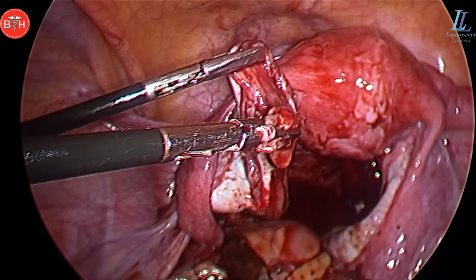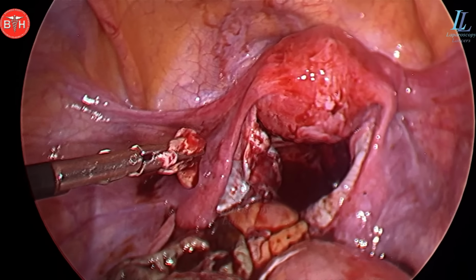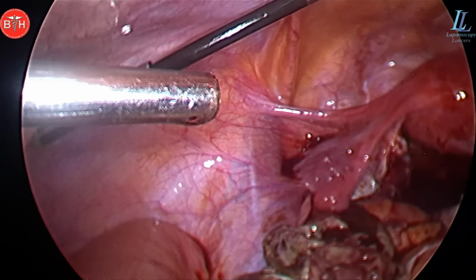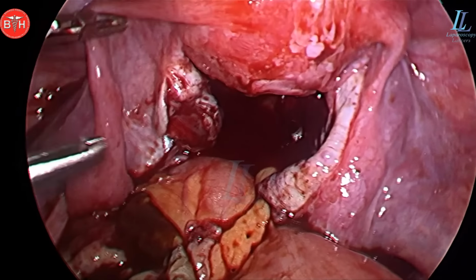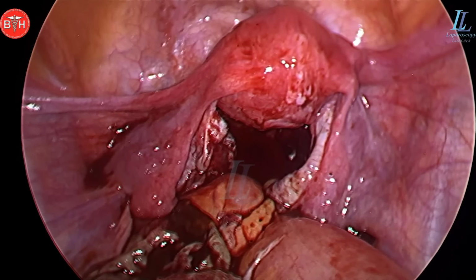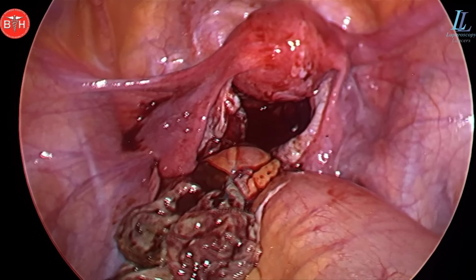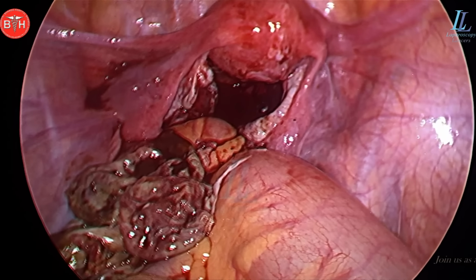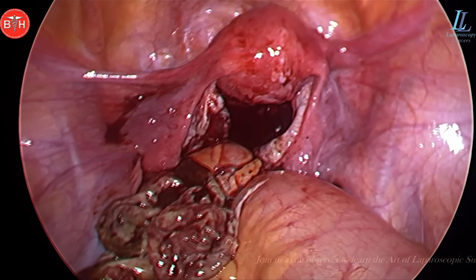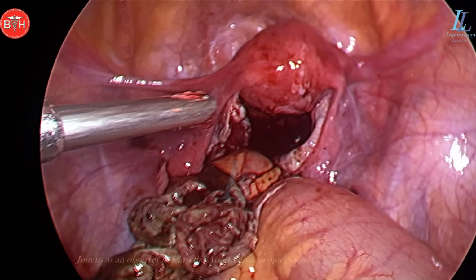Removing all the bit of endometriotic tissues from the ovaries, and practically she is cured of endometriosis as far as the ovaries are concerned, and she will get pregnant normally after maybe 1 or 2 months of this surgery. As the fallopian tubes are clear, we will not be showing the chromopertubation in this case, as the recording was done on the other system, as hysteroscopy was also done, so that's not there in this video. And obviously both tubes are very well patent.